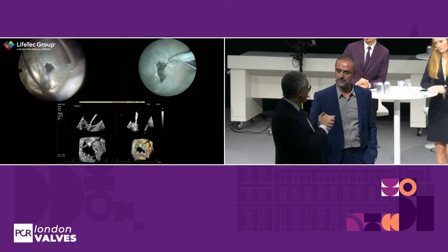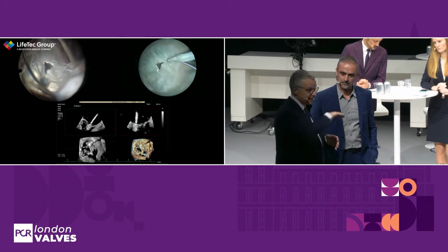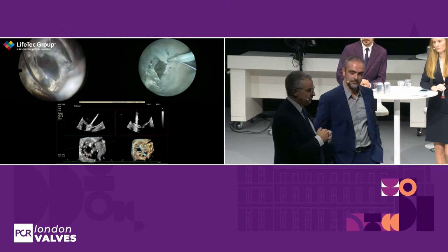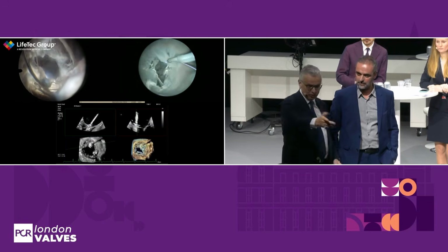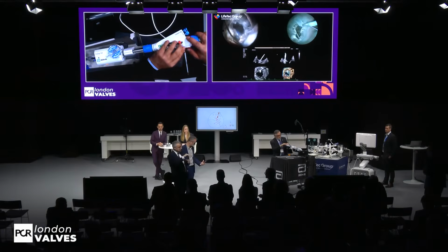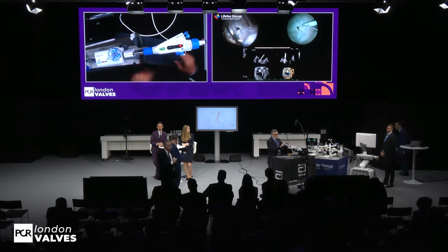But in principle, the problem is that sometimes to obtain this effect, you are scratching on the lead. You are doing manipulations that can be difficult. What you mentioned before, somebody's using, you mentioned, you can use an Agilis or other tricks to manipulate the position in order to have it very, very posterior.